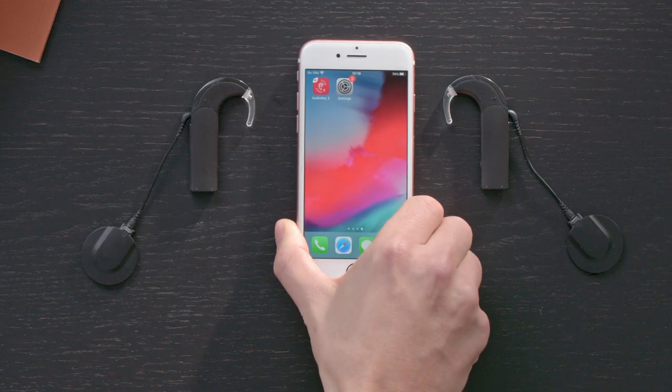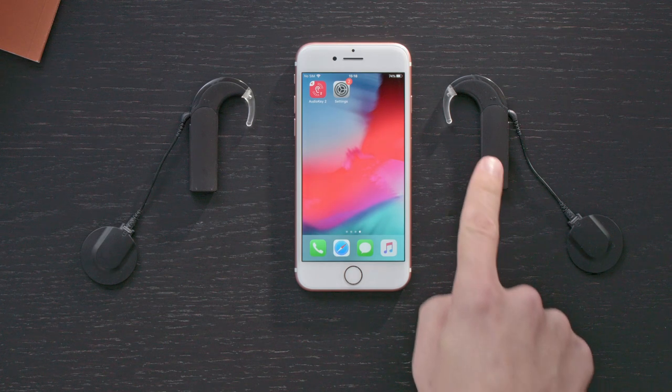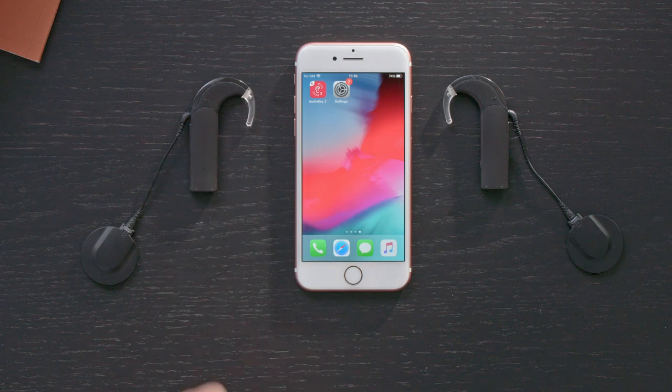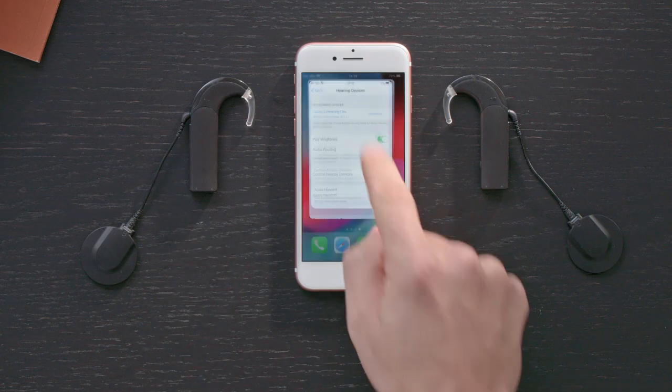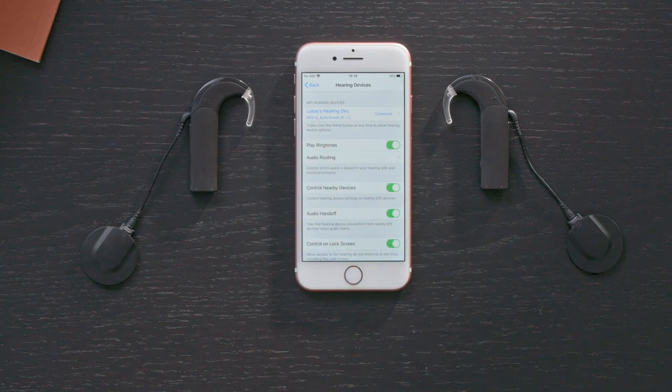With AudioStream, you can stream audio directly from your phone to your Sonnet Series audio processor. To stream music or other audio from a mobile device, make sure that AudioStream is attached to your audio processor. Ensure that your AudioStream is paired with your phone and a Bluetooth connection is established.